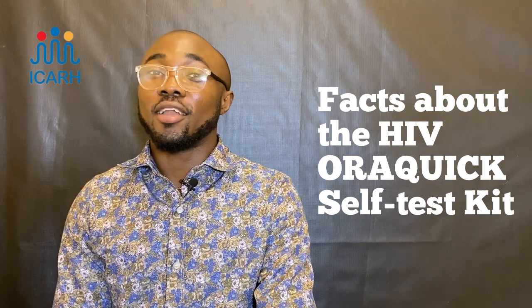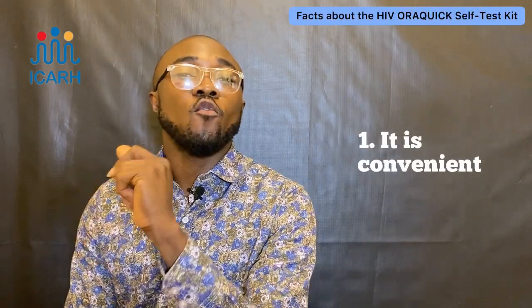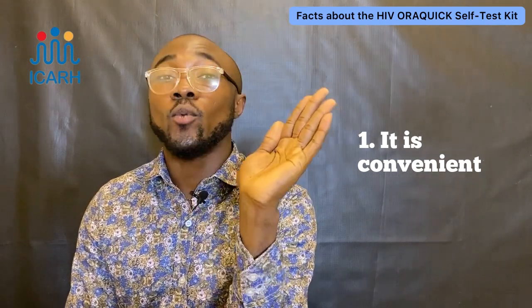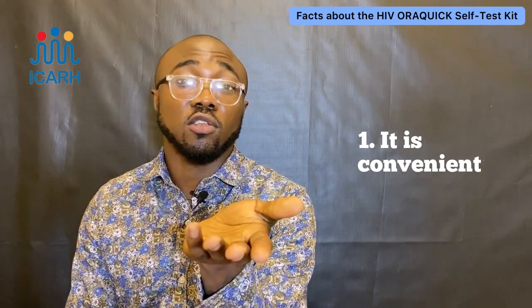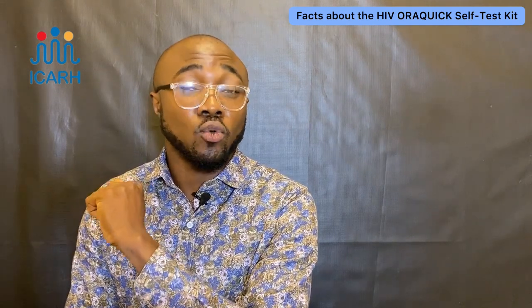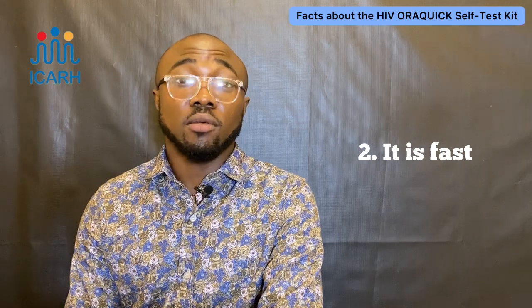Number one, it is convenient — you can do this test at the comfort of your home or anywhere you feel comfortable. You don't need to go to a facility or any healthcare center to do this test. Number two, it is fast — just about 20 minutes and your result is out.